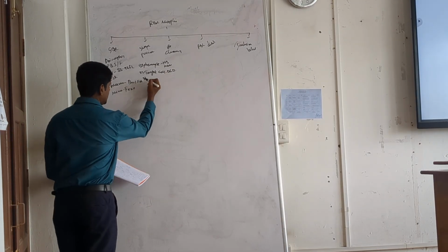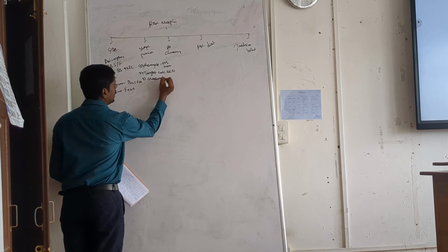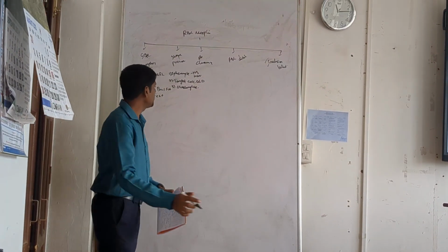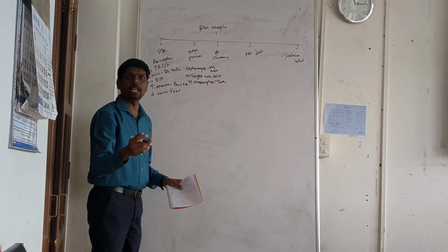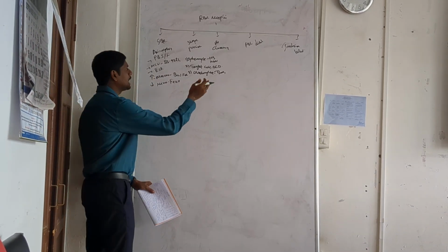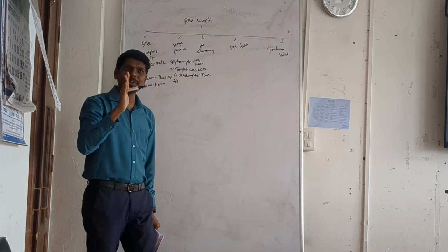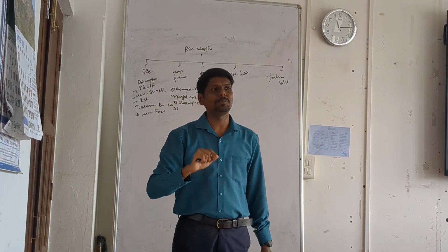Then third one we discussed, what is the third one? Ovalocyte. What is the reason to get ovalocytes? Thalassemia, very good. Do I give any more examples? Sickle cell anemia, but for sickle we have a dedicated cell. So thalassemia is called ovalocytosis. If you remember, why ovalocyte in thalassemia? Can you recall the reason why it is ovalocyte in thalassemia?